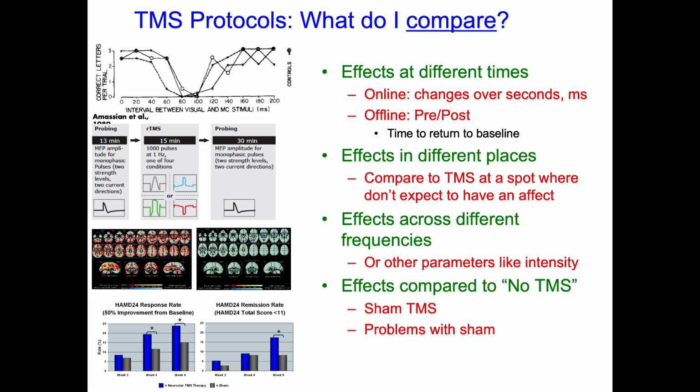You can also use, and actually the first thing people might think of is, well, I could do TMS and then not do TMS, no TMS, and compare what happens when you don't do TMS and when you do. The problem there is TMS itself has its own effects, peripheral effects. When you stimulate on the head, it feels like something, and the more you increase the intensity, the more it feels like something. So you contract muscles on the head, you affect peripheral nerves and things like that. It's usually just kind of startling. It feels like a little bit of a thumping. It can be painful sometimes in certain places, and for instance, if you hit the right superficial nerve, you can create an eye twitch, you can twitch your jaw. There are peripheral effects that you create. So if you do no TMS versus TMS, you're creating effects in one case that can interfere with tasks that have nothing to do with affecting the brain. So that's something of a problem.